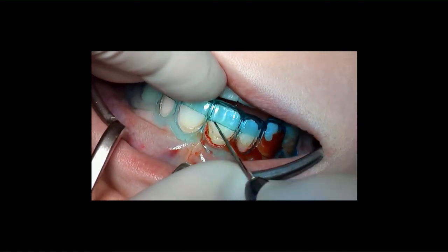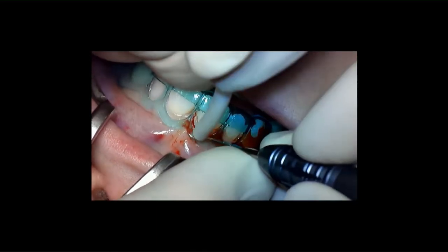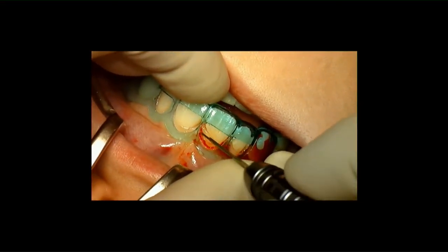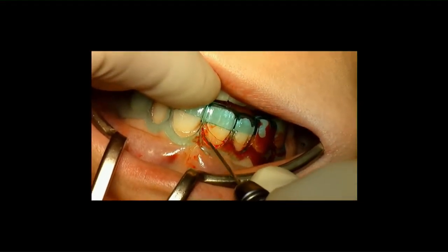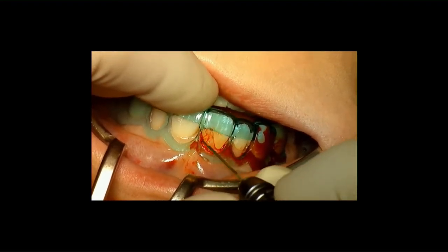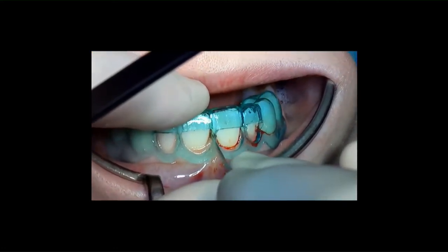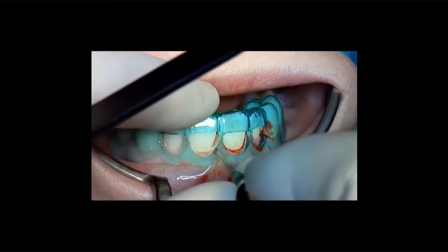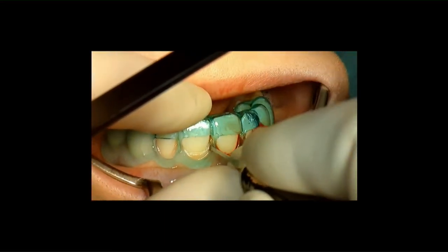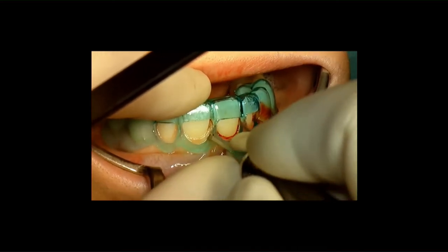So I normally start out with an SR microblade. However, I found that there's another blade, a bendable tunnel blade that has a flat surface, that actually works better. I will show you that. Yeah, here it comes. That's the bendable microblade for a tunnel preparation, but it works great for these cases.